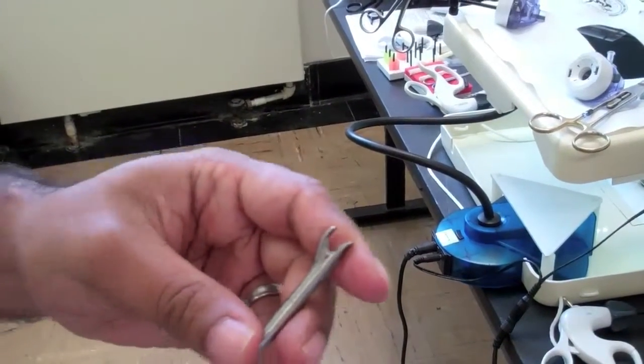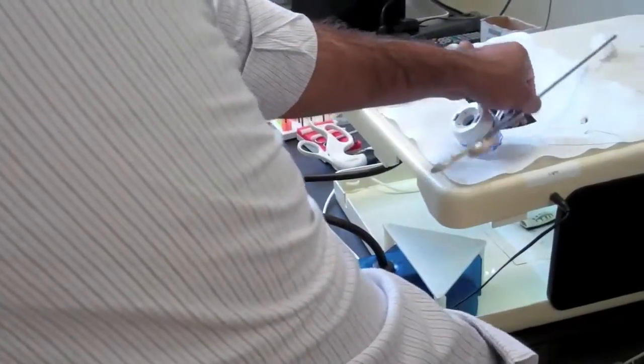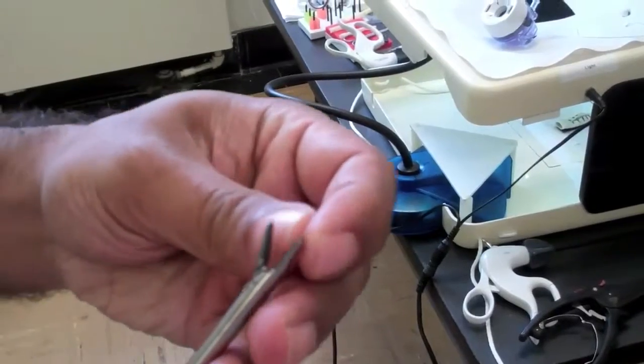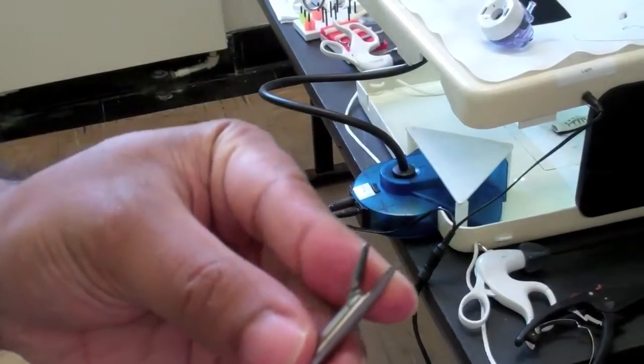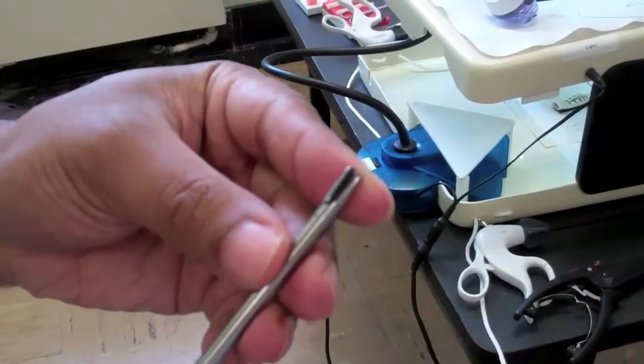learning or knot tying. The needle drivers in the operating room are much like the other ones, which you see here. See, the bottom is smooth here, and that allows the needle driver to turn at a 90-degree angle so that you can control the angle much better.